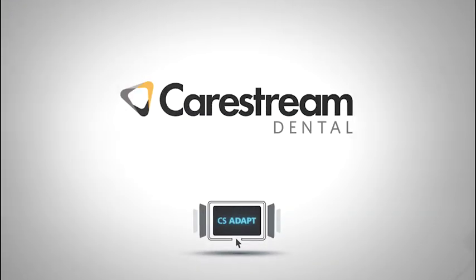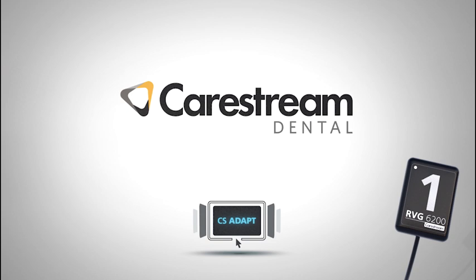For revolutionary technology tailored to the way you work, make the RVG 6200 your preferred system.